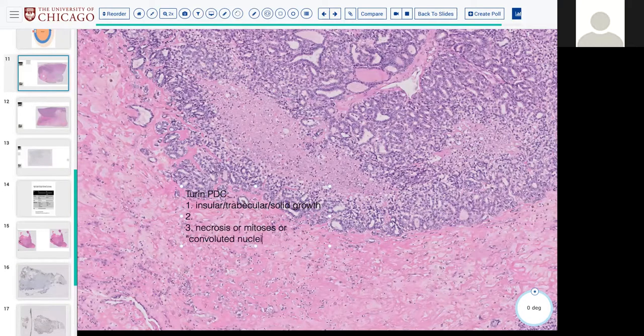And the one that Manisha said that we're missing is, as I remember, even the presence of one focus of necrosis is unacceptable, all the time. If you think it is true tumor necrosis, not an FNA infarct, yes. If you have strict criteria, one focus of tumor necrosis in these contexts is enough, because really, how often do we see true tumor necrosis in thyroid neoplasms? Hardly ever. So when you see it, it's bad.